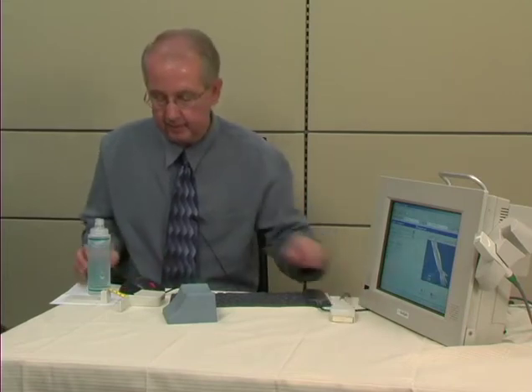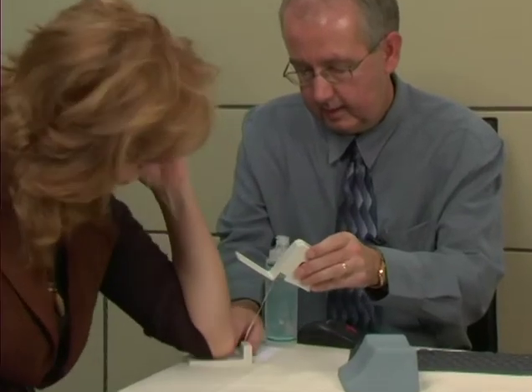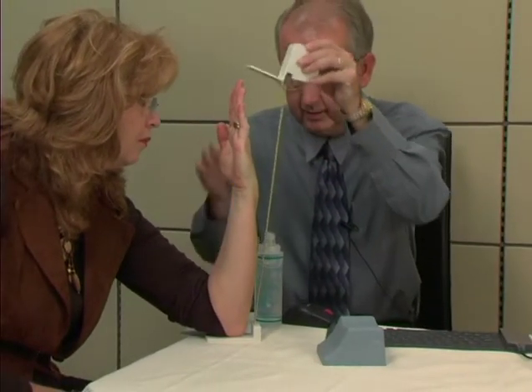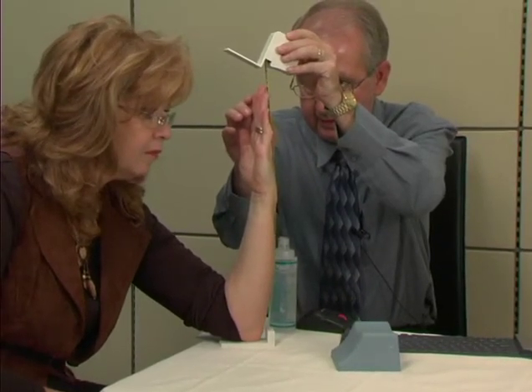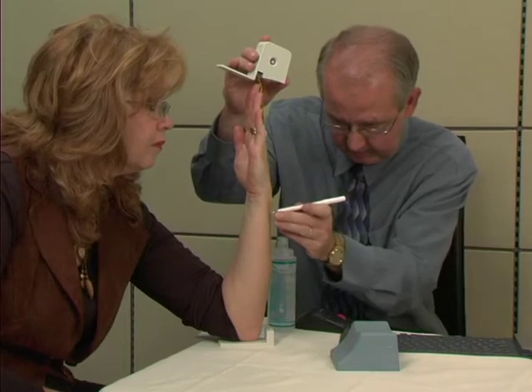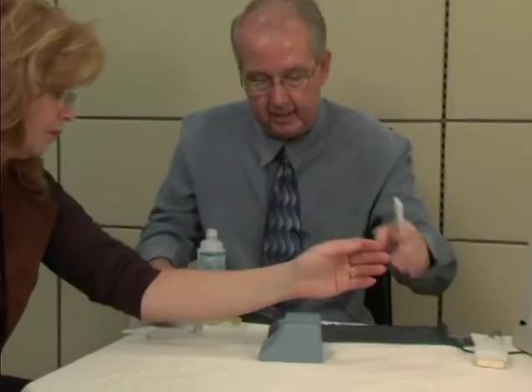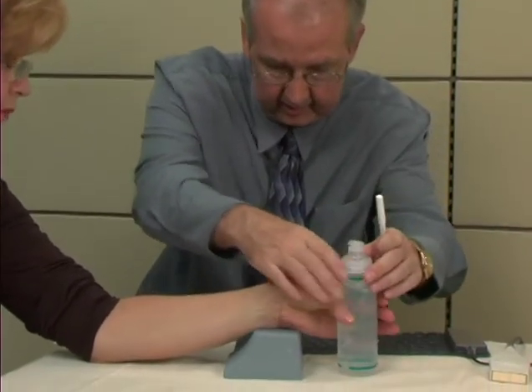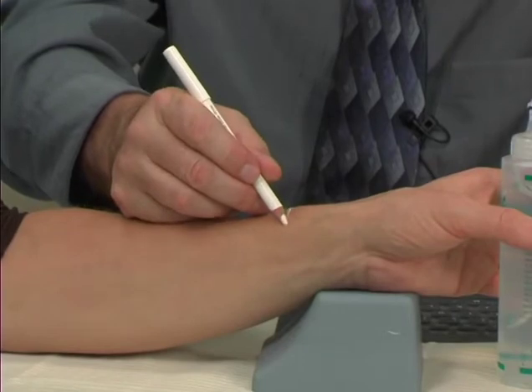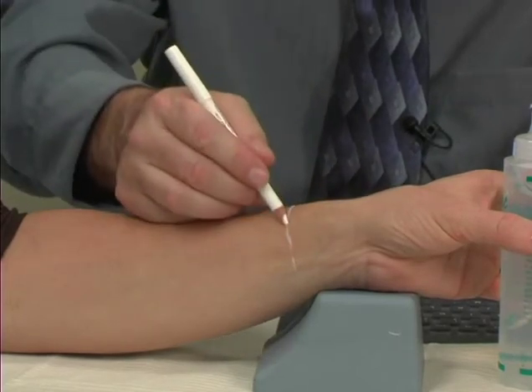What I need to do first, Mrs. Smith, is measure the length of your arm. We have a handy measuring device here. If you'll just put your elbow into this right up square with the edge of this device and extend your arm out, with the tip of your finger as high as it'll go, I'm going to measure to the very tip of your finger. I see that it's 45 centimeters. So I'm going to take my marking pencil and take half of that, because that's where we want to measure. So at 22 and a half centimeters, I'm going to put a small mark. Now if you'll just put your arm down on top of this rest and hold on to this bottle for me — with your arm away from me, I'm just going to extend that line around your wrist. That's going to give me an area from which to measure, because your radial bone actually runs up from your wrist right up to your elbow.